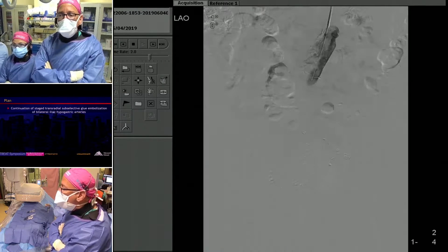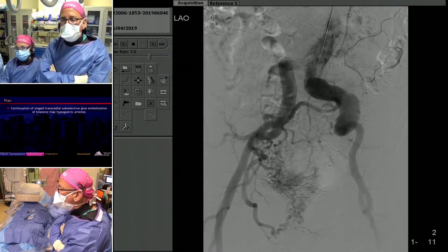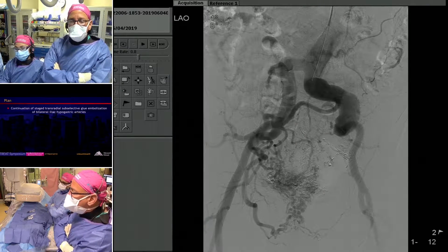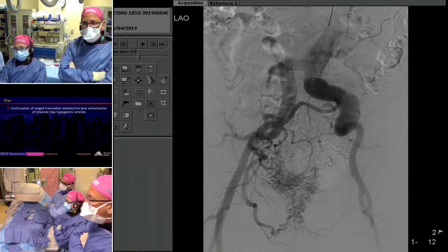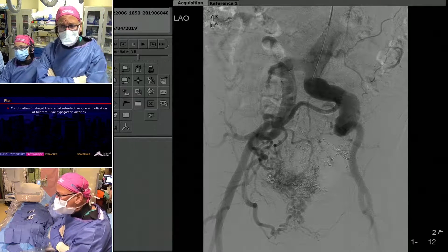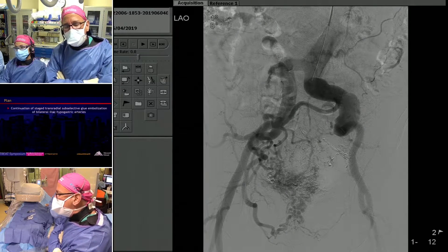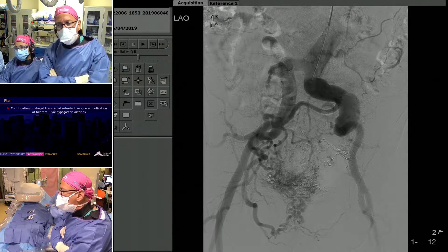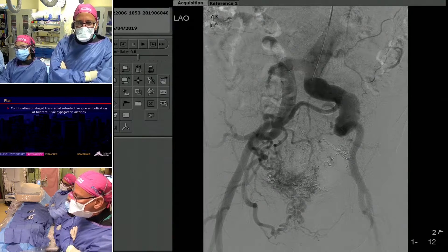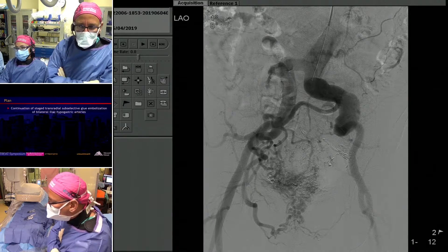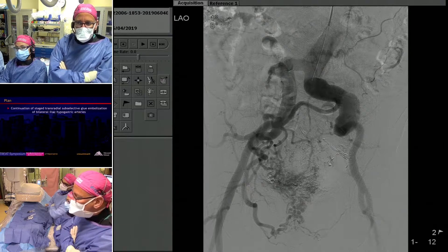On that run you can see there's a lot of glue filling the pelvis. Most notably, there's a paucity of perfusion from the left internal iliac artery. While it's still certainly enlarged, the anterior division of the left hypogastric has really been debulked. You're seeing a very small percentage of the perfusion or shunt from the inferior mesenteric artery, and the rest from the right.